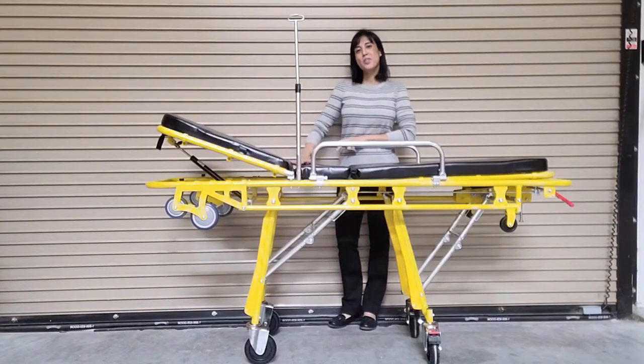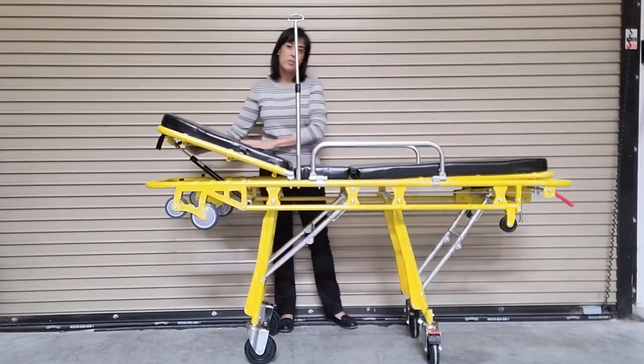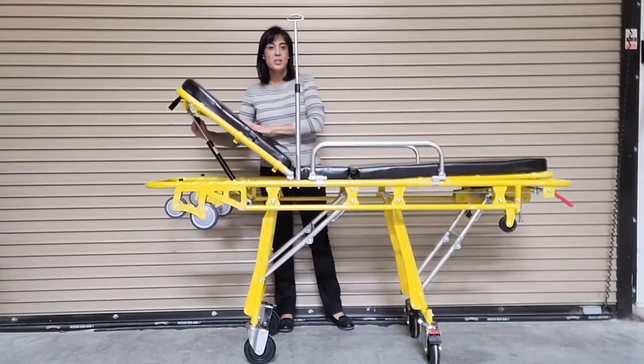This unit comes standard with a 2-inch foam mattress. Both the backrest and the footrest are adjustable. To adjust either of these, simply pull the lever located behind the rest and adjust to the desired position.